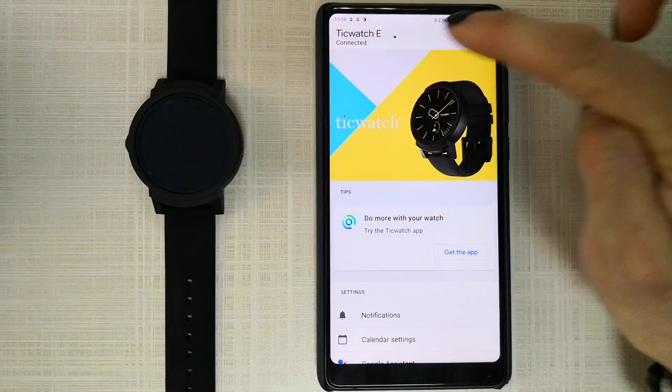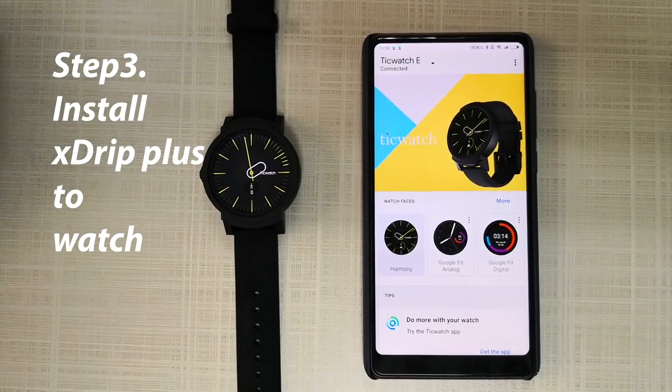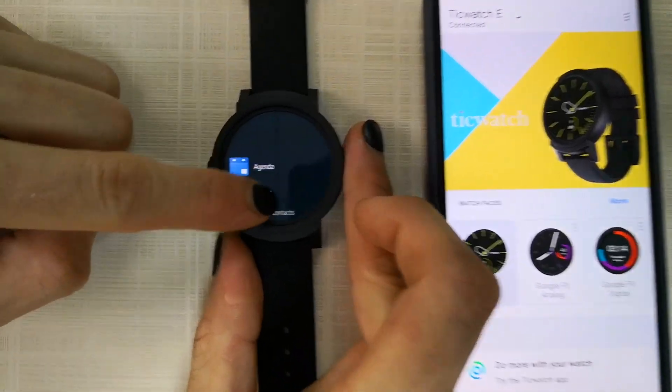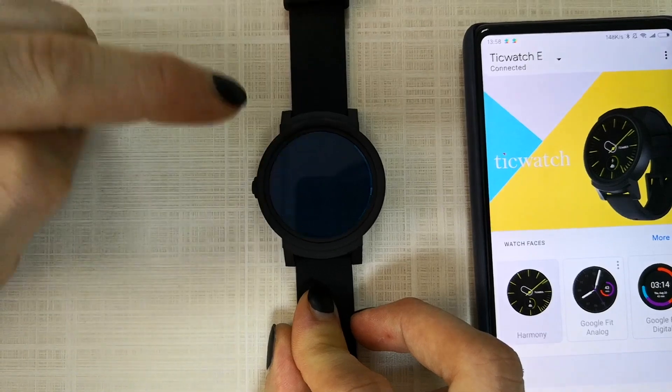Now you're all set. You will see it's connected. Set up your watch and go through the tutorial. After that, go into the Play Store — press this button here and go into the Google Play Store.